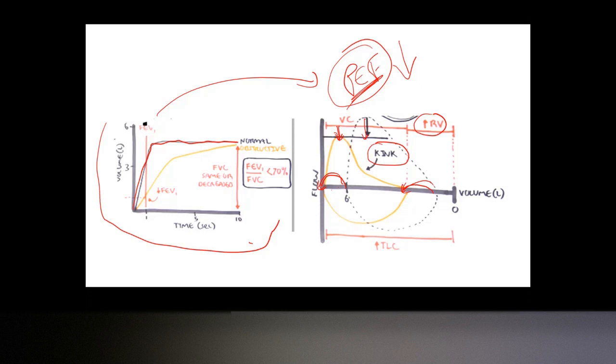In emphysema, in bronchitis and asthma, there is inflammation in the trachea. So again, the lumen diameter is decreased. Both of them result in the FEV going down. So instead of having the FEV at 3 liters, it becomes 1 liter. But because we have discussed that the vital capacity remains the same, this is how the graph is formed. So we use these two values, FVC and FEV1, to construct the graph, and then we can use the ratio.